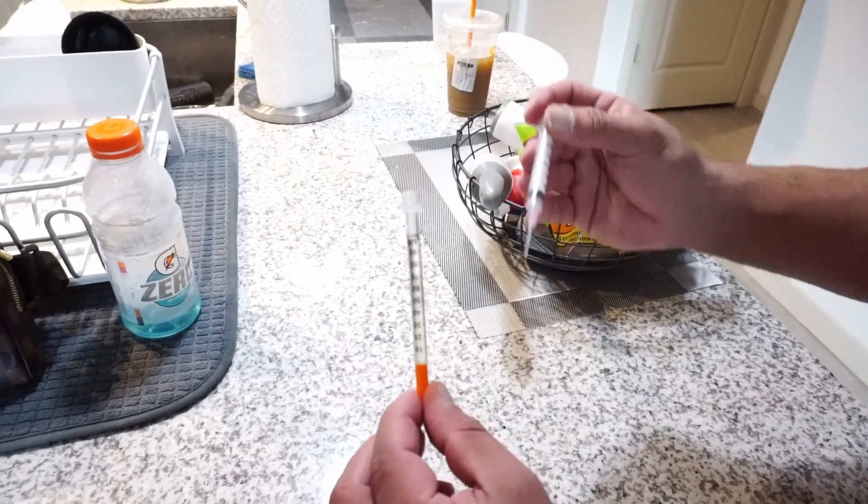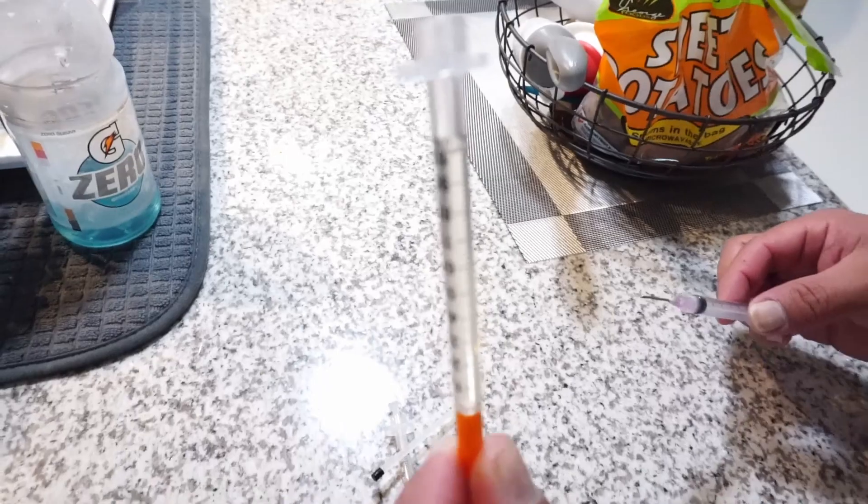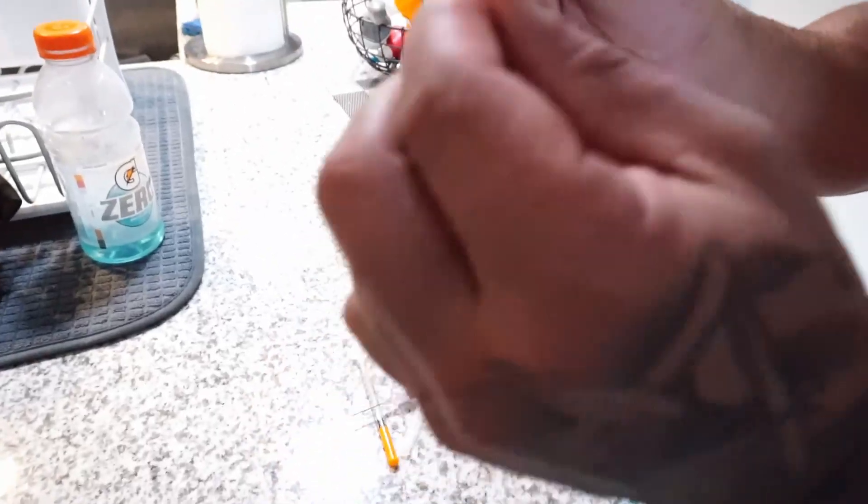I put one CC in there, exactly at a hundred units — you see that? Okay, you get this and you get this. Make sure this stays this way because the oil will spill out. So you're gonna plunge it through. You don't want to compress it all the way through — you see that little bubble?